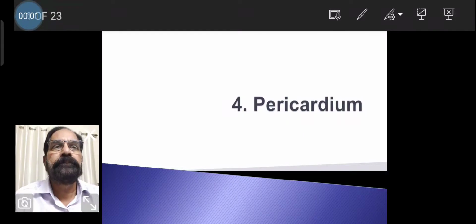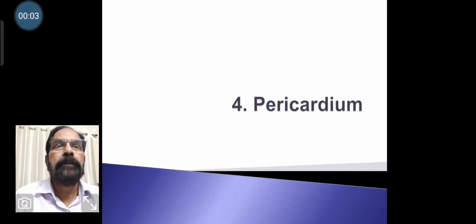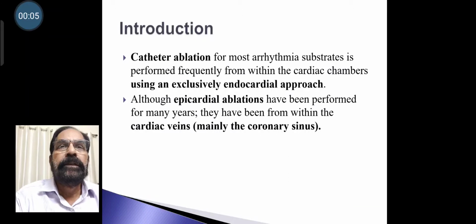Pericardium. So, in this catheter ablation for most arrhythmia substrates is performed frequently from within the cardiac chambers using an exclusively endocardial approach.